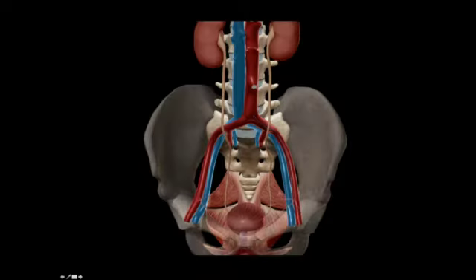When you're trying to look at the ureter as it crosses the pelvic brim, you need to press fairly firmly here. Here's the umbilicus at the bifurcation of the aorta. Press hard in longitudinal here, take a cross section across these vessels, and you may see, particularly if it's distended, the ureter crossing there. And occasionally you see a stone as it sits just here, pausing as it dives over the pelvic brim.